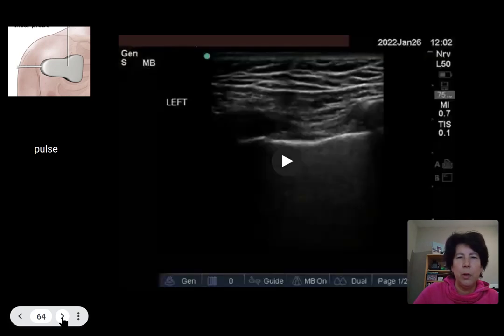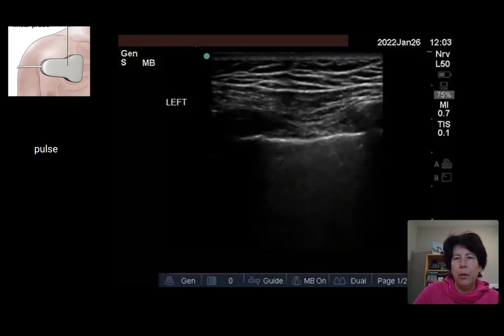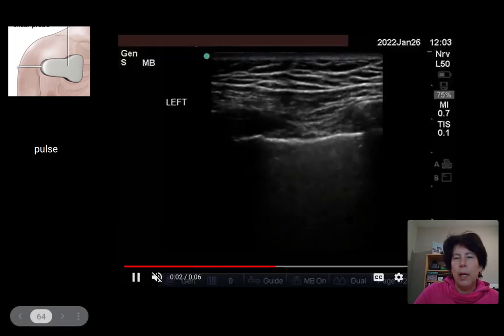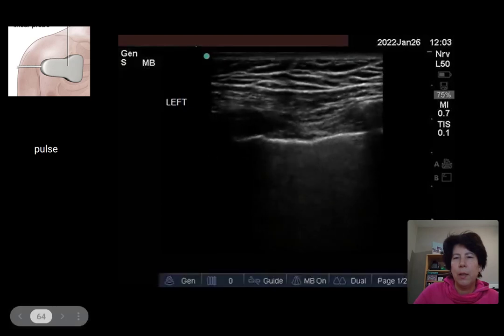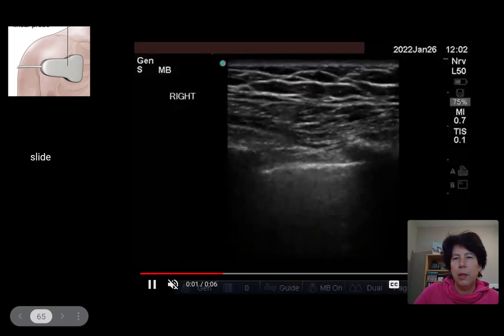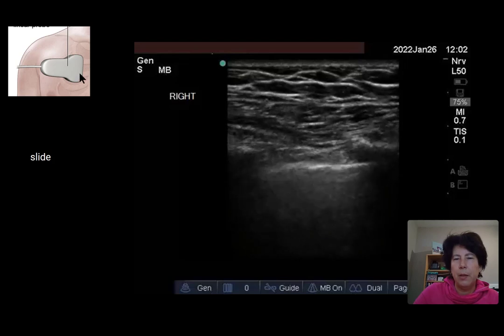So our first thing that we're going to look at is our linear probe. Mostly in the OR, we can stop ventilation and really record that lung pulse. So that's good to look at, so you know what that looks like in your normal patients. The more normal you look at, the better your eye gets. So that was pulse, this was slide. So you would do that on each side, left and right, and upper chest.